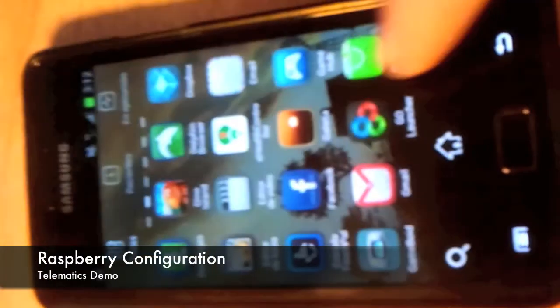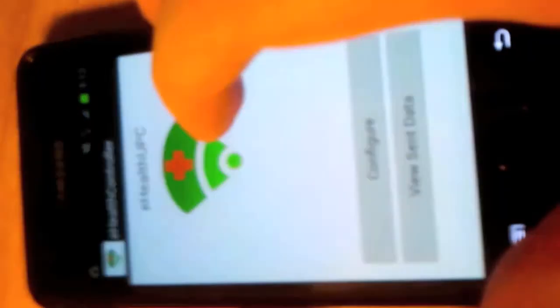And here it is, the Android app. We will first use it to configure the Raspberry. As we see in the screen, we must introduce the device code, name, user ID, device ID, doctor name, and medical center. When we press Configure, the Raspberry will be allowed to connect to the server.